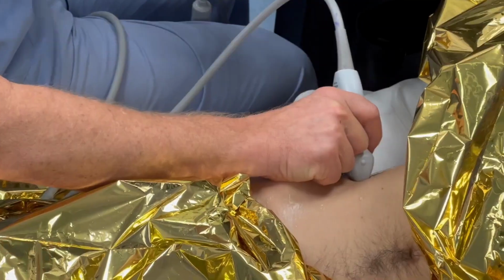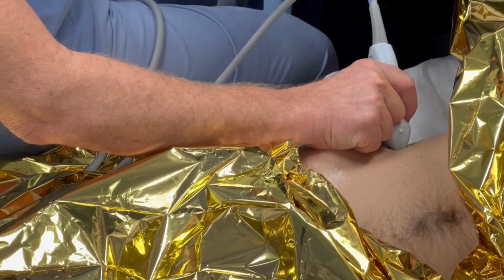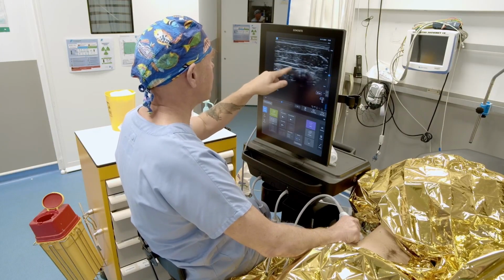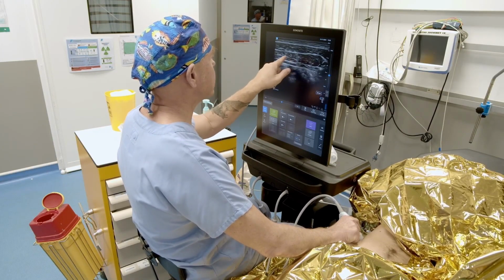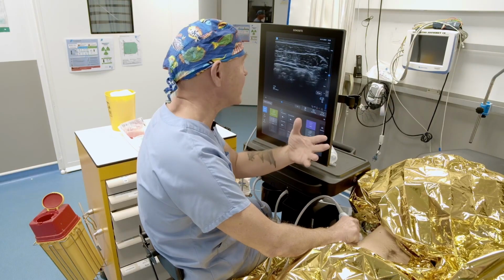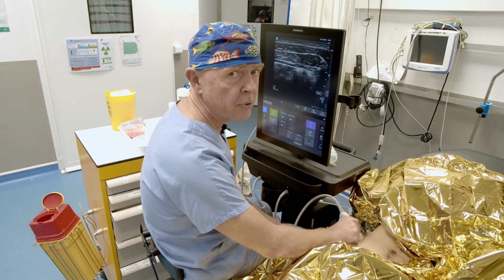Move it a little bit. Now this is characteristic. You have the three layers, the intestines moving here, the transversus, the internal oblique, and the external oblique. So a TAP block is that. Afterwards, your effectiveness will depend on where you position your probe.